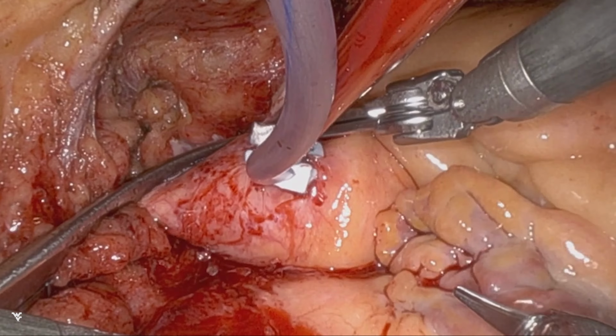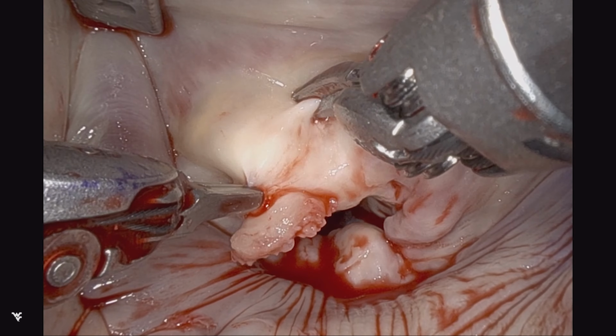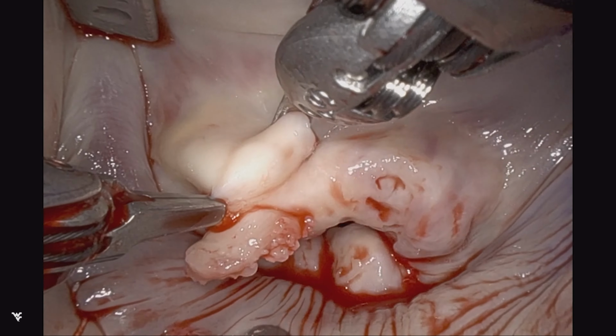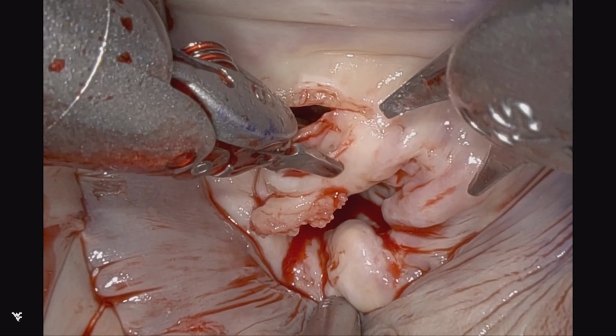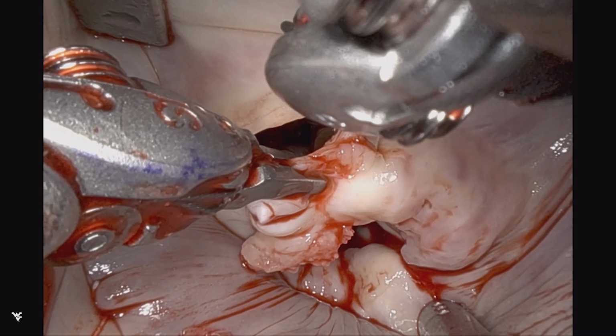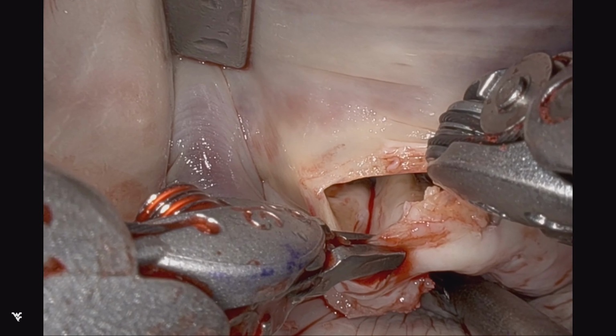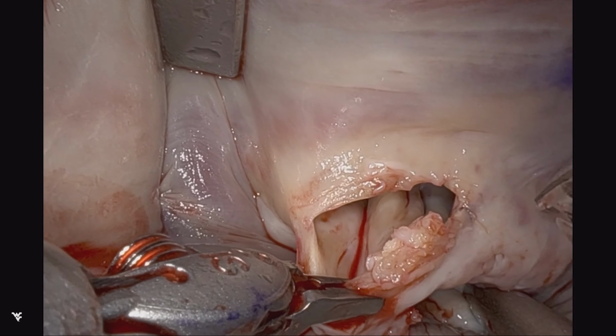fibrillation with rapid ventricular response, congestive heart failure, and somewhat decompensated state with rheumatic disease. It may even have some infective endocarditis, as you can see there, but essentially rheumatic disease. A biatrial Cox maze has already been performed, as you've already seen previously in a previous video. And now we approach this valve.